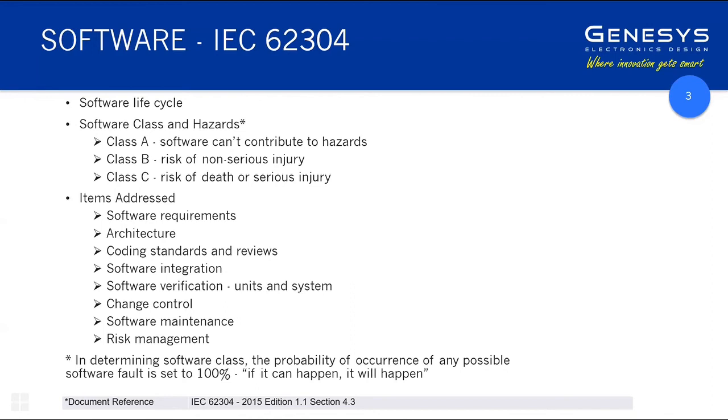If you have a device, for example, that is doing some kind of cancer detection or something along the lines of that, if you misdiagnose that person because of some misuse or some issue that appears in the device, then that's considered a potential risk to the patient. So it still falls in the class B. It's not just direct hazards that happen on site at the time.